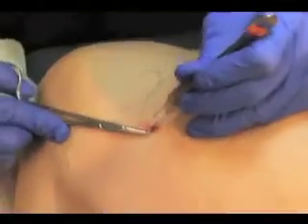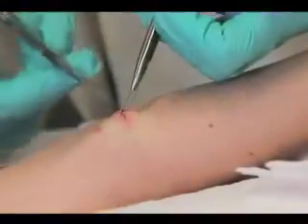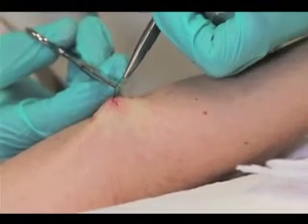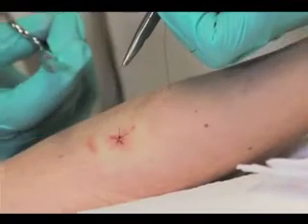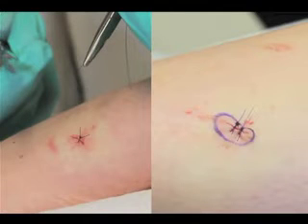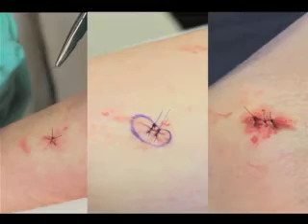If a second suture needs to be placed, you can pierce the entire wound without going through the center. Place one, two, or three simple interrupted stitches depending on the size and location of the defect. For an area measuring less than three millimeters in diameter, a single stitch is sufficient. For an area measuring four to five millimeters, place two simple interrupted stitches. Place one more stitch for every one millimeter increase in size thereafter.